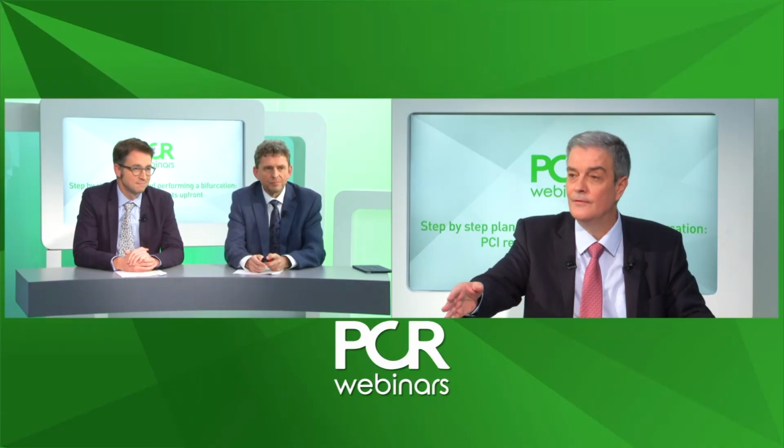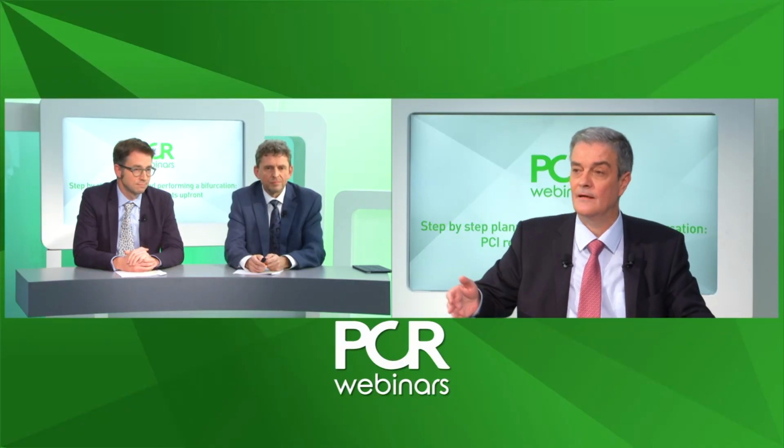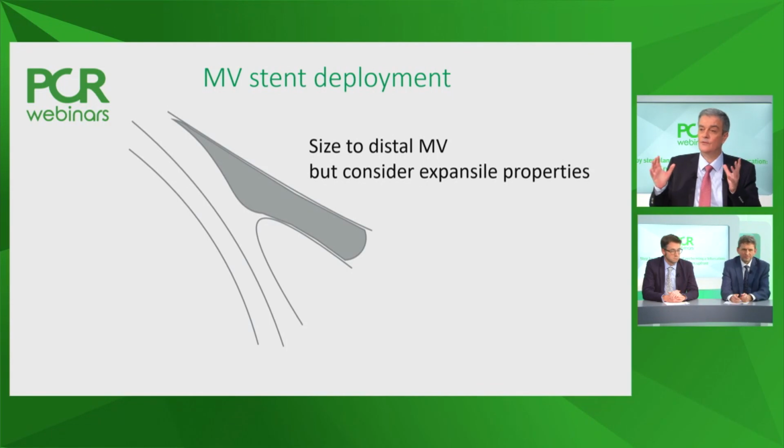If I can interrupt just for a second, for the audience. I spoke with Professor Chen, who invented this technique, and I said, why don't you simply just inflate the balloon inside the stent without the main vessel? Because I was personally afraid if you do kissing in a non-stented main vessel, you are oversized and there is a risk to dissect proximally. And he said, I'm doing it on purpose, because if you do kissing, you actually don't allow metal to protrude inside the main vessel. So that's the main rationale behind the first kissing. Please continue, Maciej. Yes, correct, and also the position of the carina.